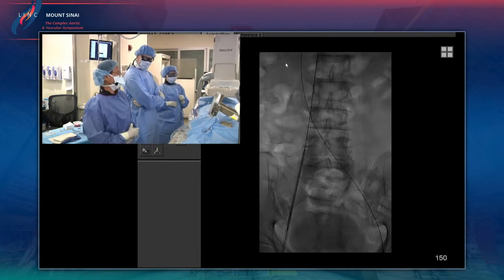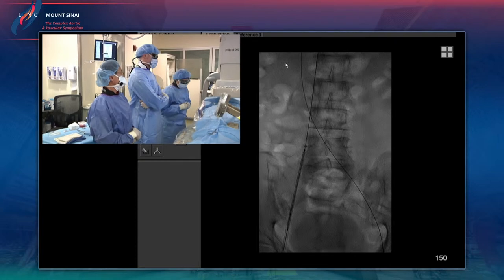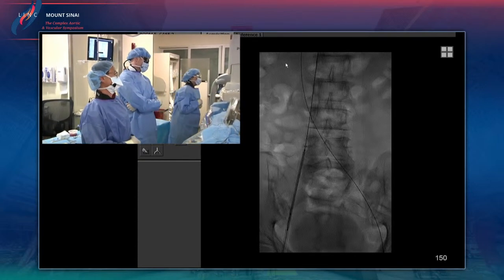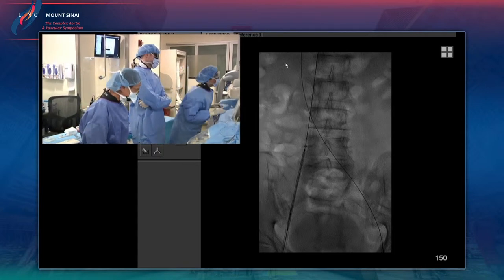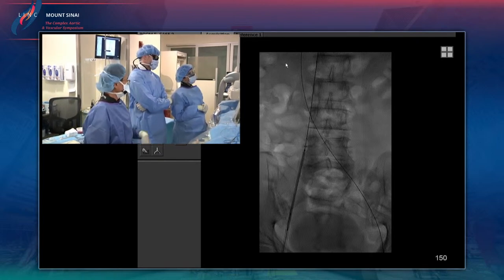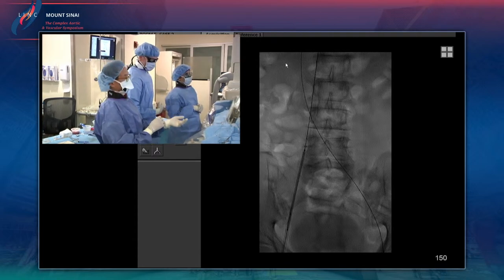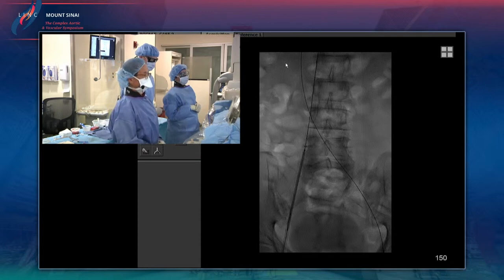So Aki, Keith, Rahul, what size stents do you guys usually use? Do you purely go by IVUS, or do you have a default size you usually use when you're doing these kinds of cases? I would say the most popular size is probably 16 millimeters, but if I have a really dilated segment based on IVUS in the reference diameter, I could go 18 and even occasionally, although very rarely, 20, but I would say 16 is probably the number one size.